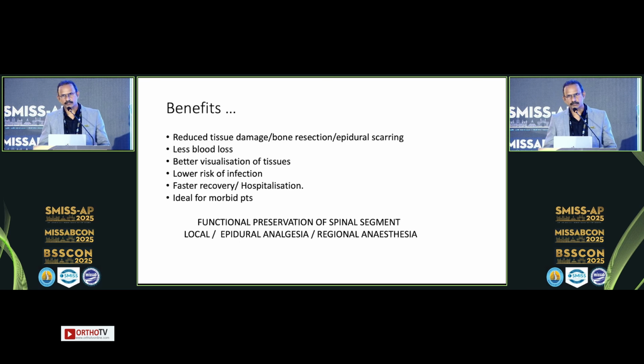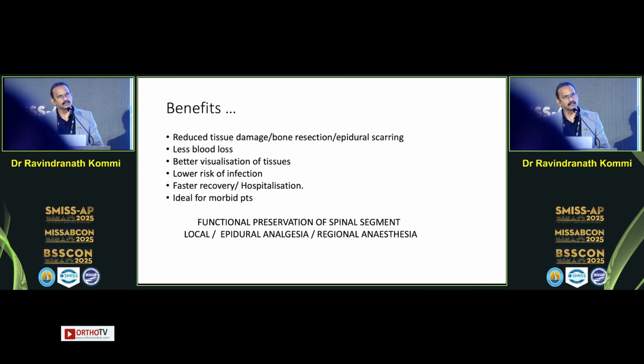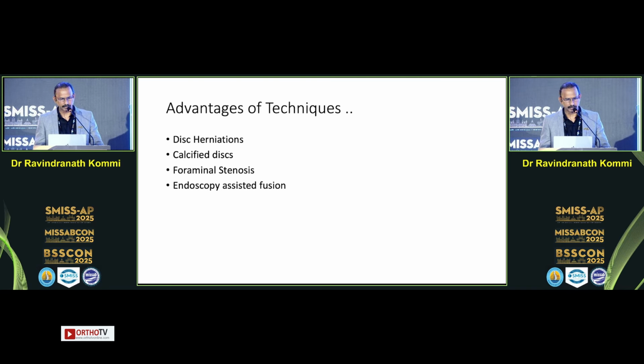These are the general benefits of any endoscopic surgery: reduced tissue damage, reduced blood loss, better visualization, and all of them finally aim at a better functional preservation of the spinal segment. And another beauty is that all these procedures can be done under local or epidural anesthesia, and if the patient is not very cooperative, we can do regional as well as general anesthesia.